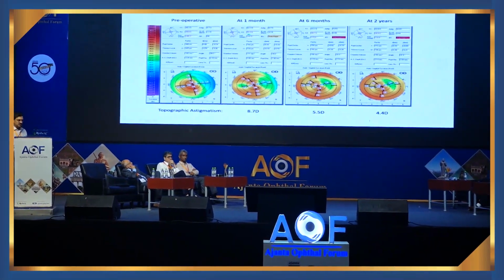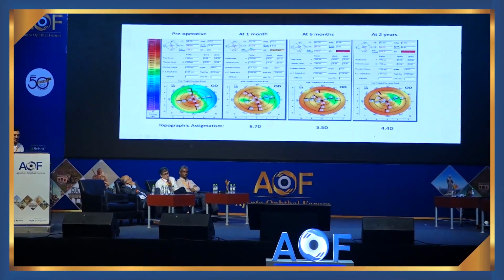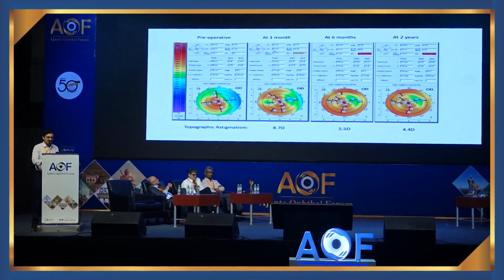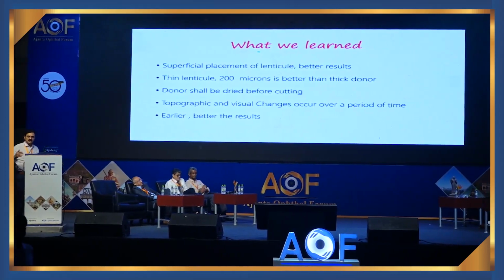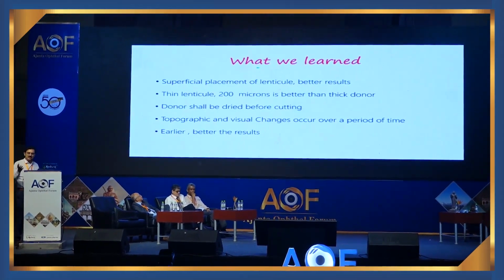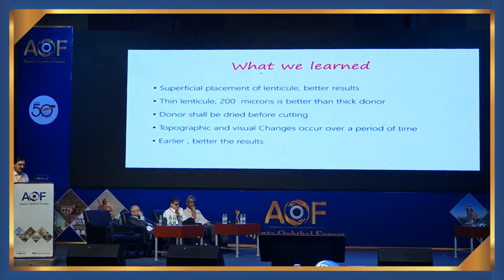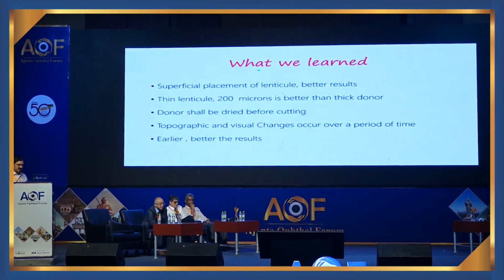The topography also improves. The flat portion, for example in the extreme right, you see a flat cornea that becomes steeper, and the steeper becomes flat, and there will be a lot of good regularization of the cornea. Topographically, it shows excellent results. What we learned is we tried a lot of things like very deep, very superficial, combined with C3R, without C3R, and reversing the lenticule. For example, you cut the lenticule this way and reverse it, so that we thought that will flatten the cornea much better in the center. And different thicknesses, 200 microns, 150, 300, 400, like that.